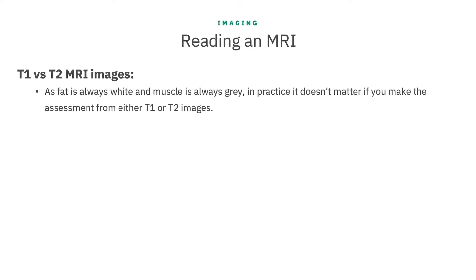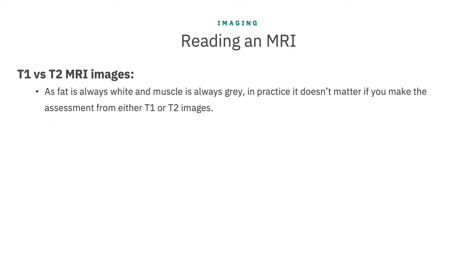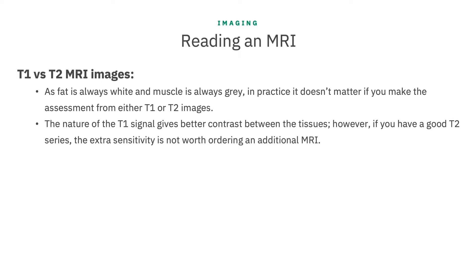For the purposes of this interpretation, what we are really trying to do is measure the multifidus and then determine the extent of degenerative changes and fatty infiltration in the muscle. As fat is always white and muscle is always gray, in practice it doesn't matter much if you make the assessment of the multifidus from either T1 or T2 weighted images. If you have the choice, the nature of the T1 signal gives better contrast between the tissues we're investigating. I'm going to use the T2 images for the rest of this demonstration to make this point.